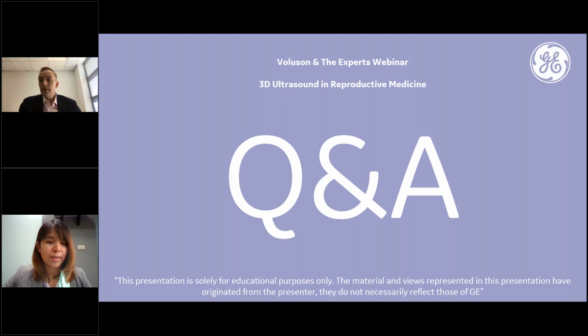Okay, we move to the next question. Are isolated myometrial cysts significant in infertility without any other ultrasound findings of adenomyosis?